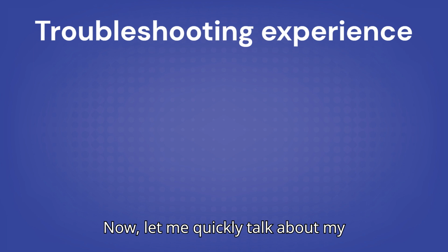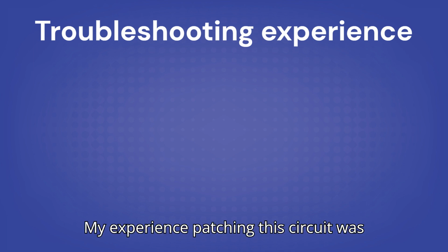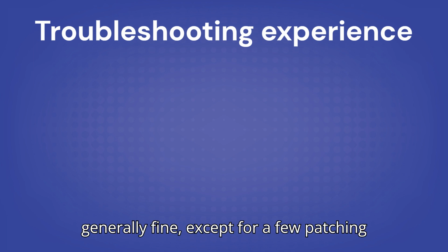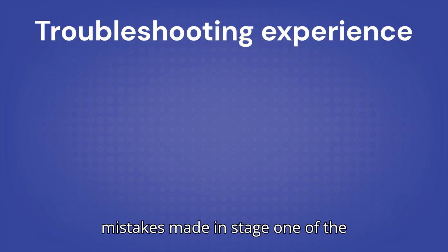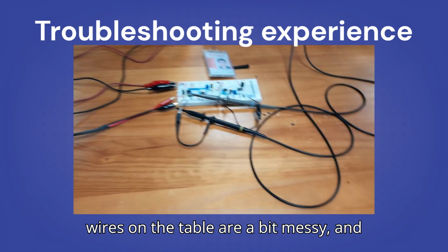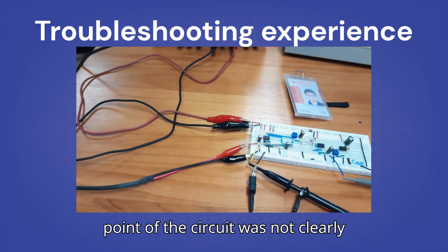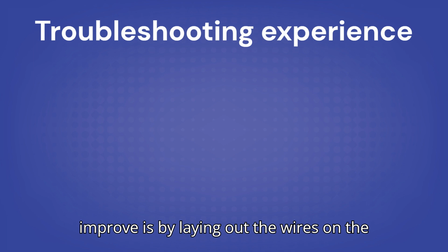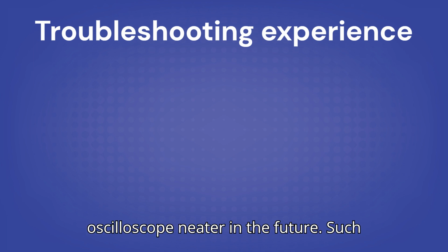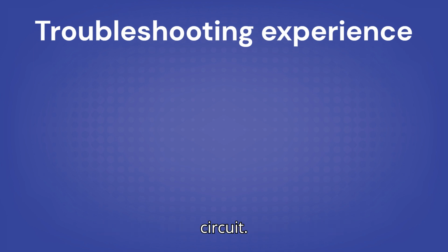Now, let me quickly talk about my experience troubleshooting this project. My experience patching this circuit was generally fine, except for a few patching mistakes made in stage 1 of the circuit. In addition, the oscilloscope wires on the table are a bit messy, and which channel goes to which test point of the circuit was not clearly indicated. Hence, one way I can improve is by laying out the wires on the oscilloscope neater in the future, such that it will be more visible as to how the oscilloscope is connected to my circuit.